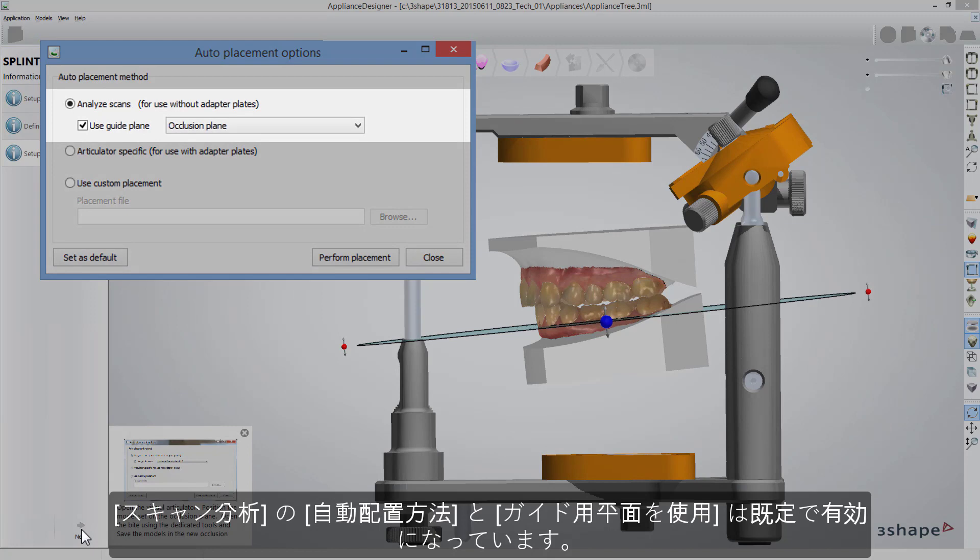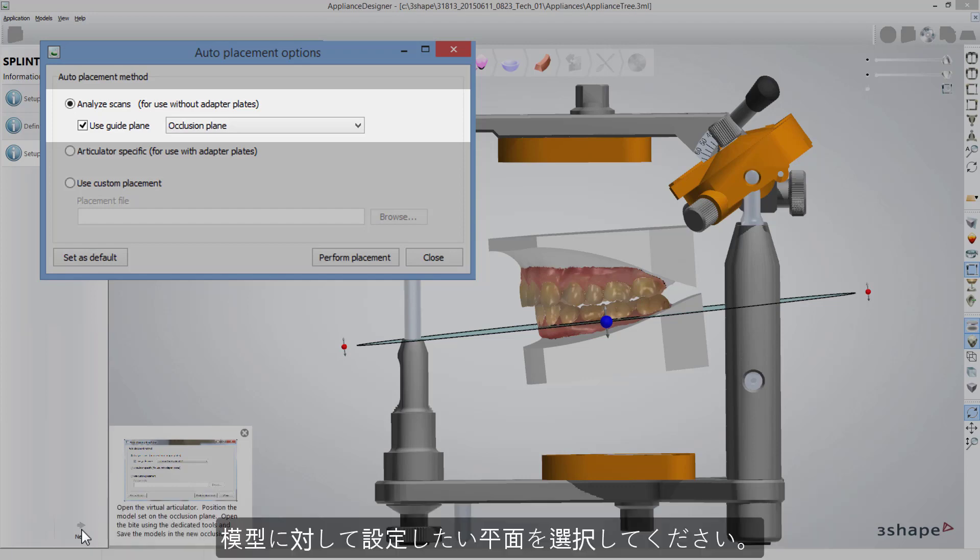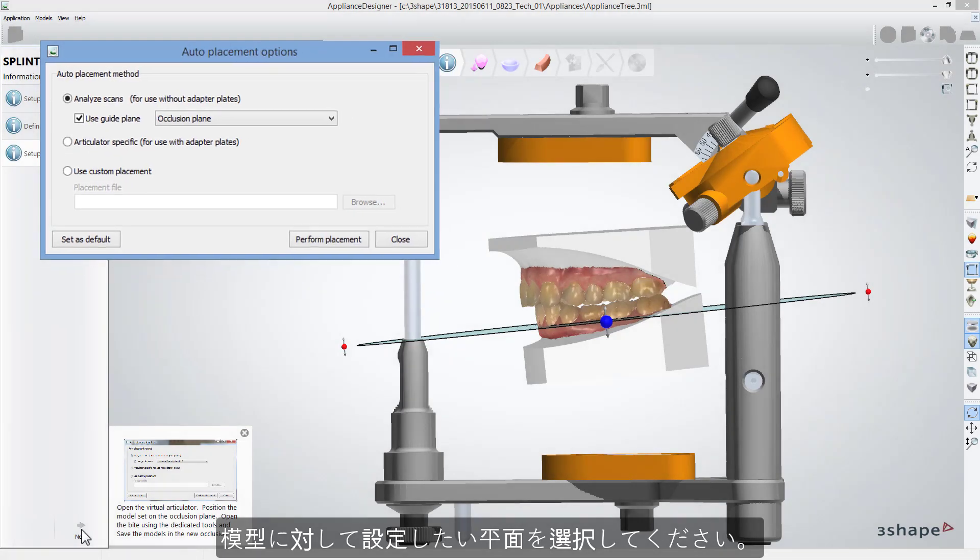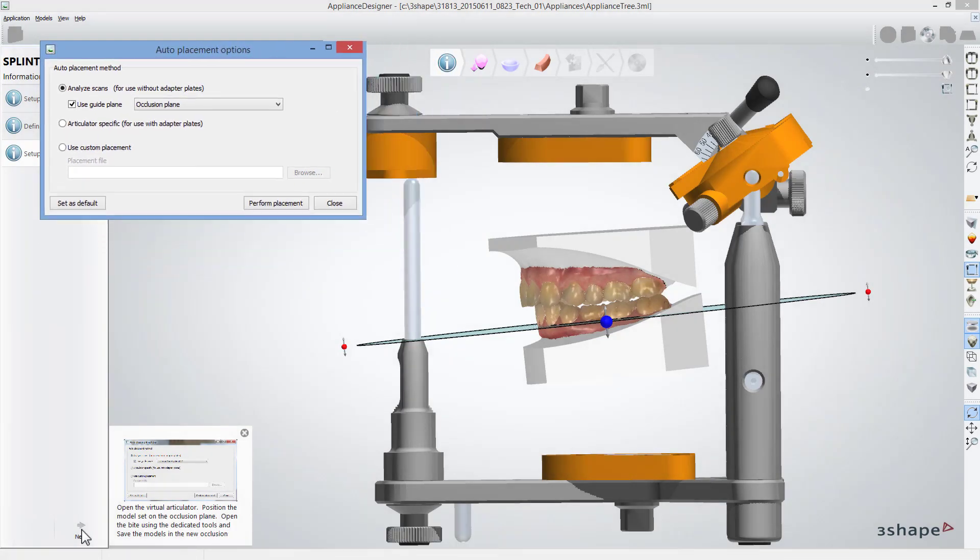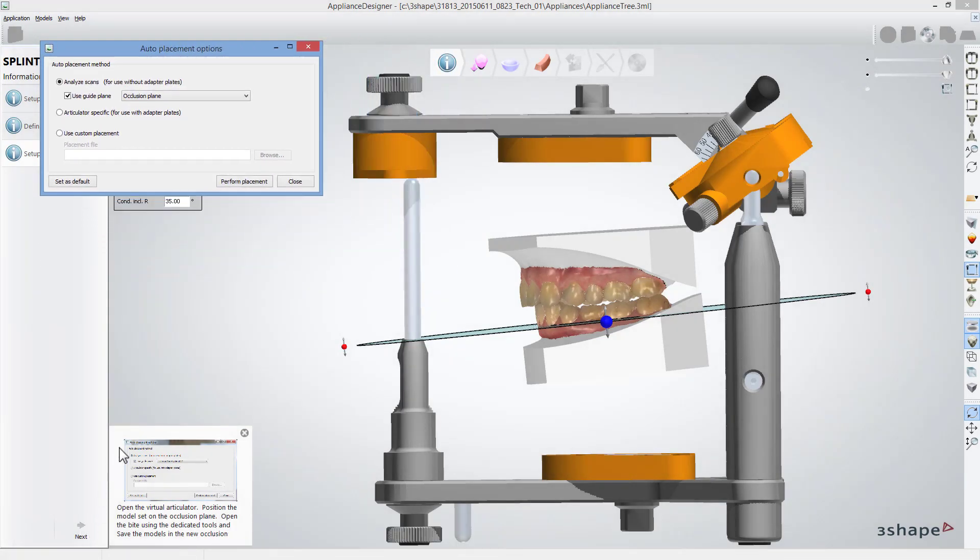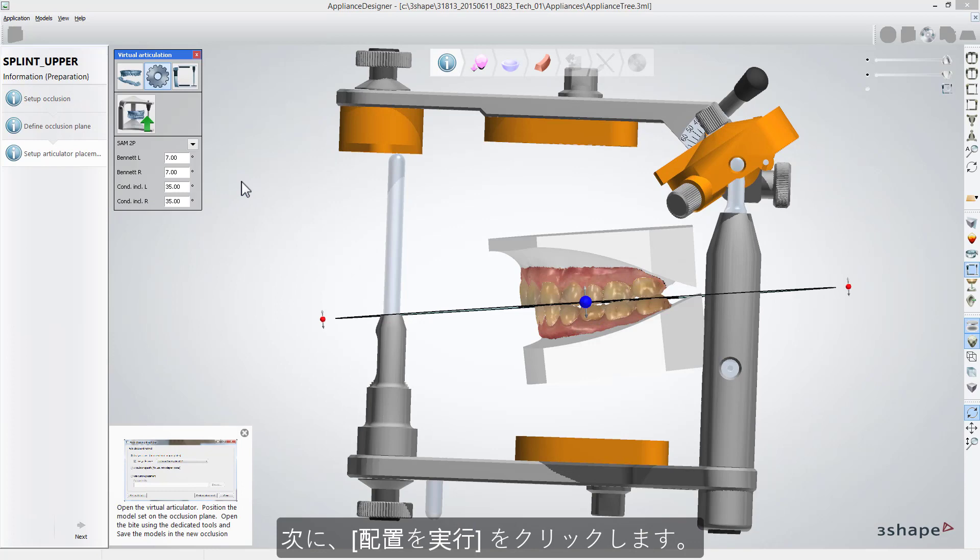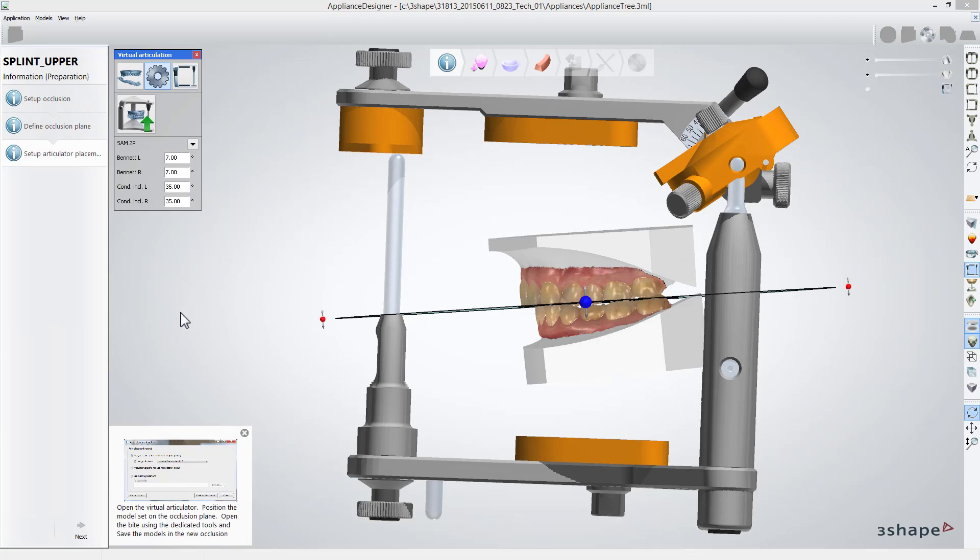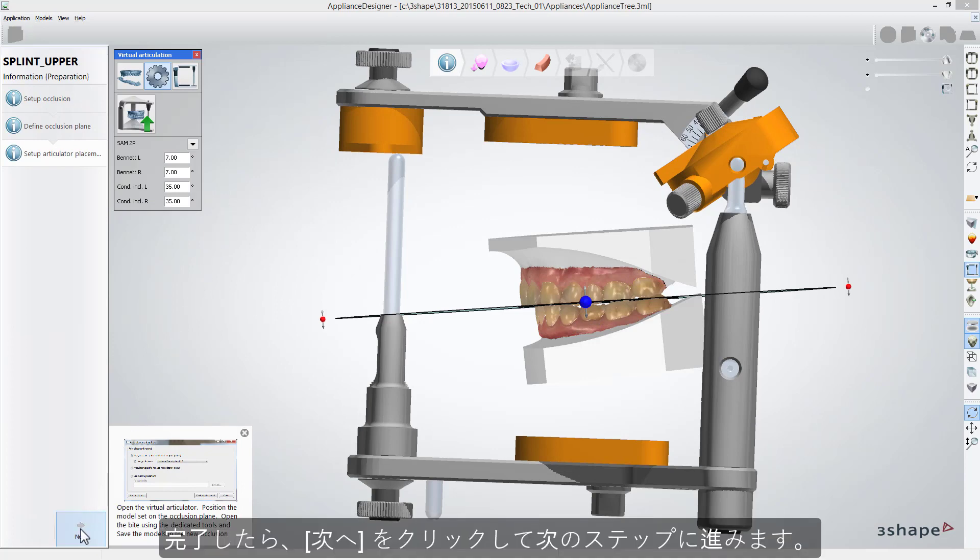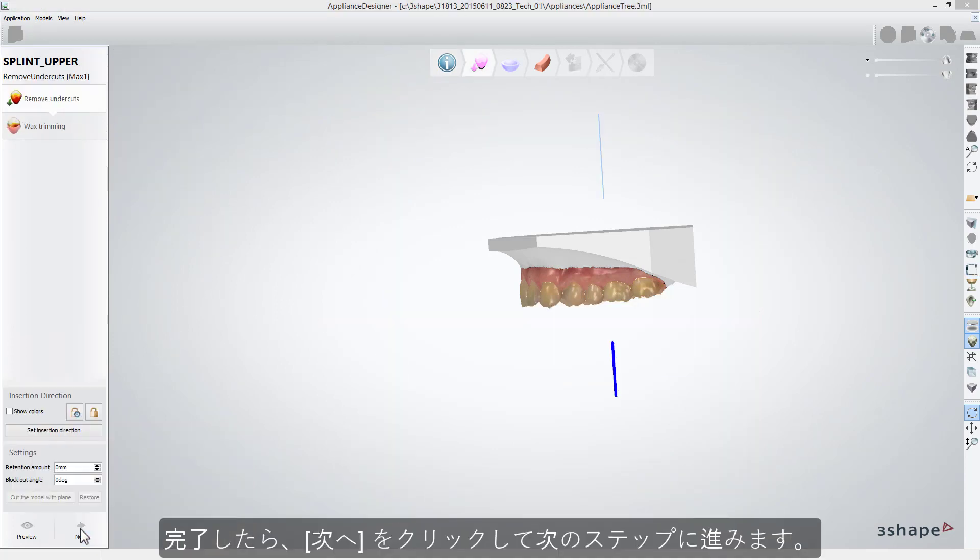Analyze scan's auto-placement method is marked as default as well as Use Guide Plane. Select Plane in relation to which you would like to set models. Then click Perform Placement to do so. When done, click Next to get to the further steps.